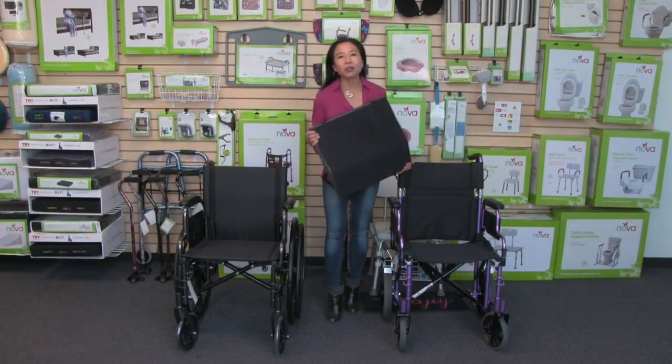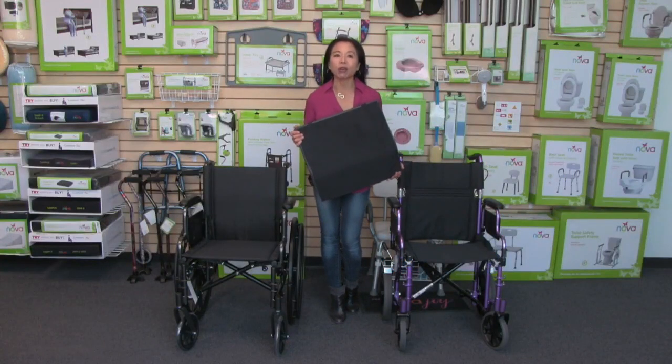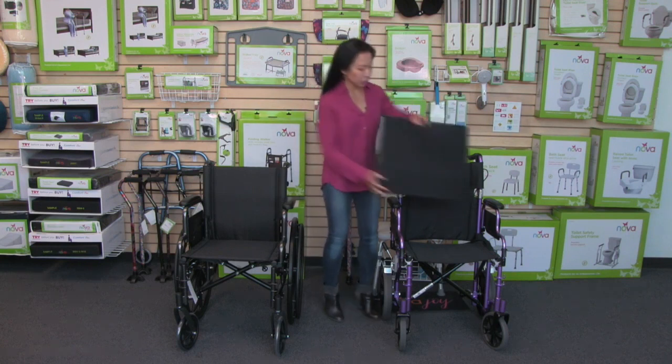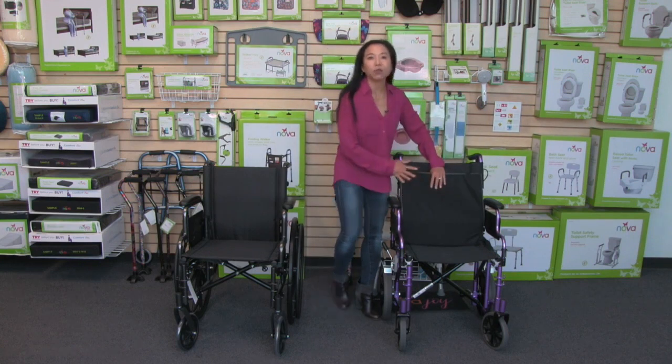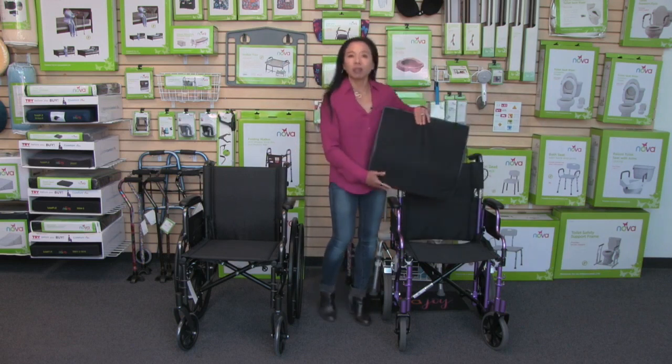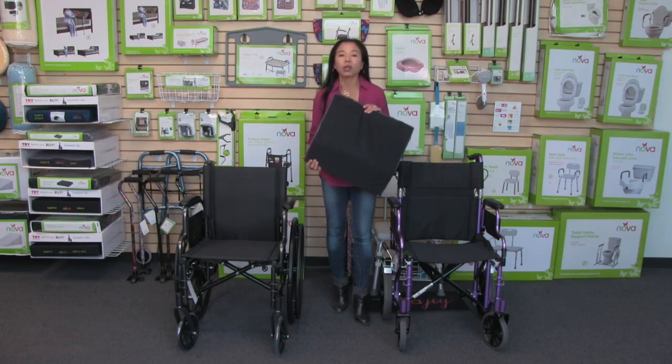This video is about the Nova Wheelchair or Transport Chair Lumbar Back Cushion. The shape of this lumbar cushion fits ideally for a transport chair or a wheelchair, and it's got that curved lumbar support and cushion for the user.